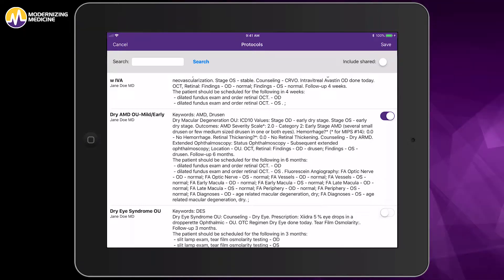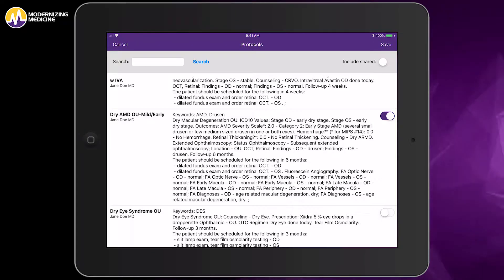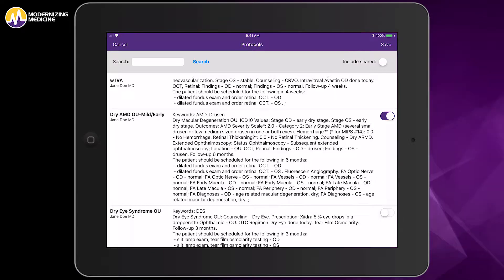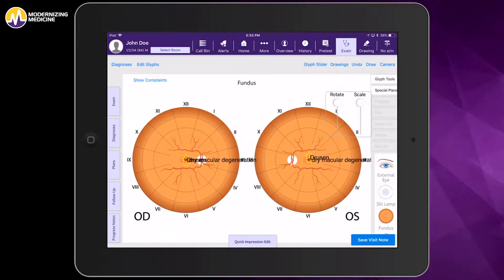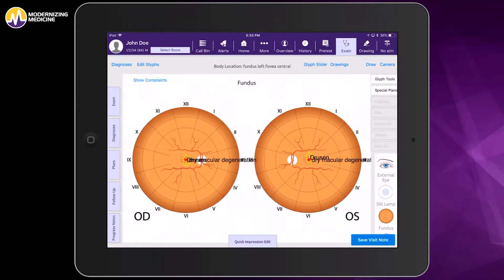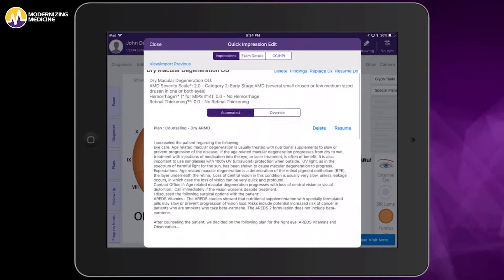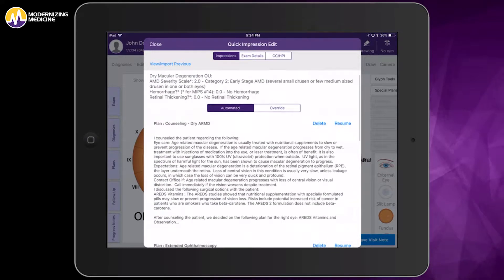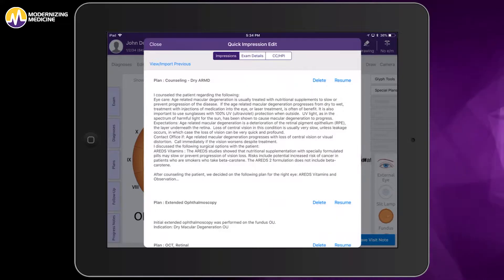You can set up different MIPS quality measures in different protocols. In this particular protocol, I also have a fluorescein and an OCT documented, along with the follow-up visit. With that one touch after I save, I now have documented my entire visit — macular degeneration in both eyes, including my staging, MIPS quality measures, and my counseling with an AREDS talk track.